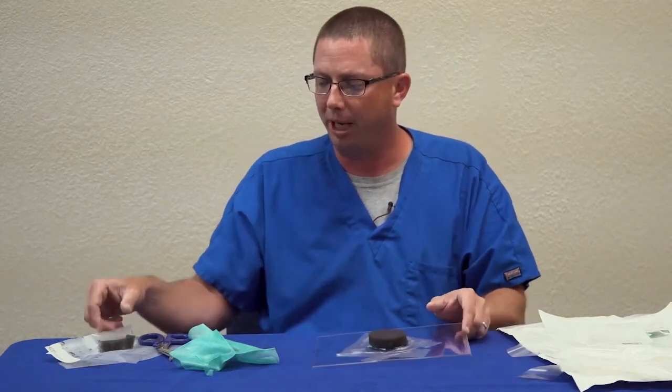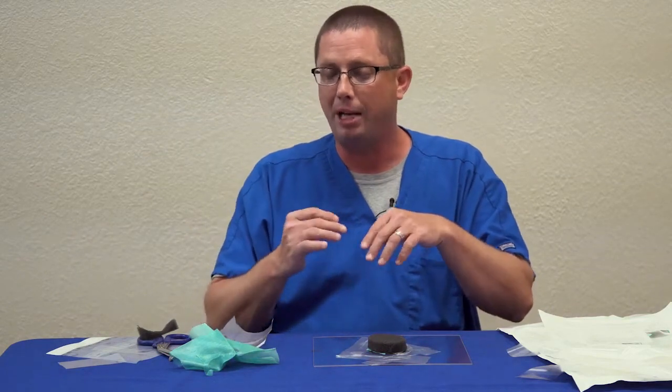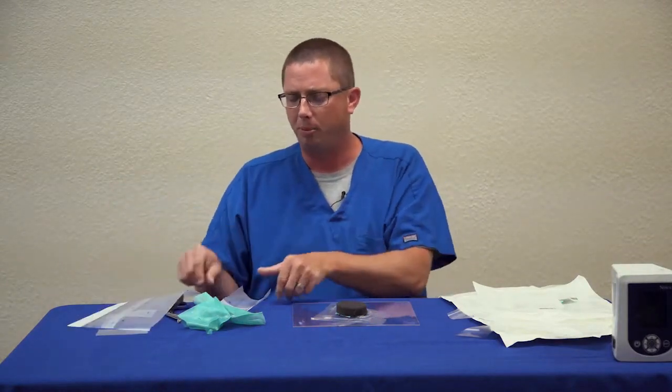So we go back to our transparent film. My recommendation is always to fill any cracks and crevices first with your drape. Do not try to cover the entire wound with one solid piece of drape if it's a difficult wound. Always cut a smaller piece.